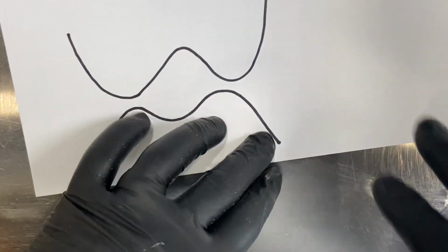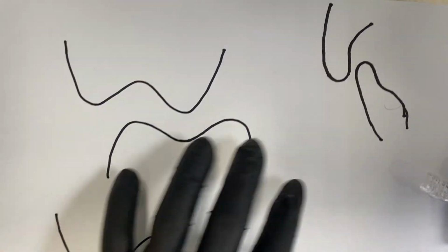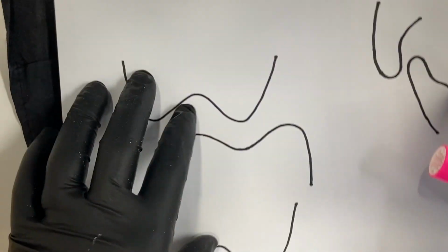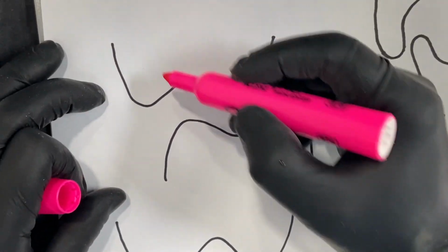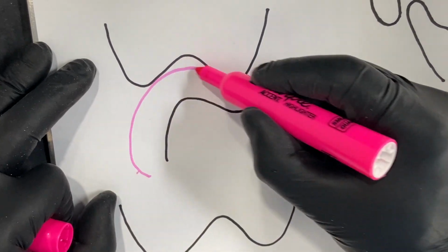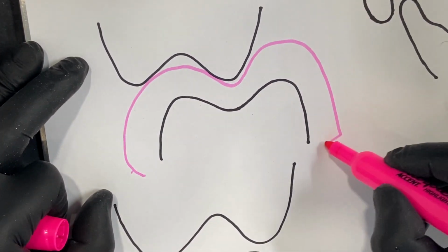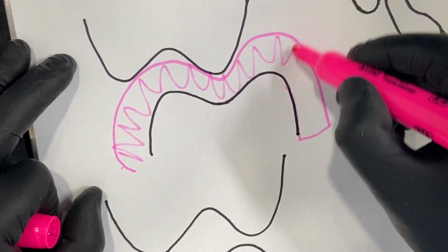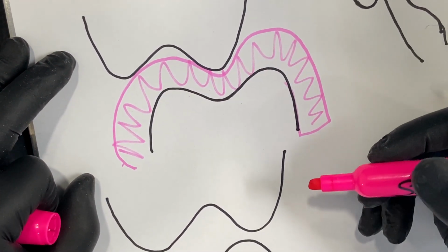Now, it's important that we understand these graphics that I'm going to show here, because this is what is happening most of the time. For instance, we have an upper model here, and this is a lower model. Technically, this is the space that we need over the lower model, and this minimal thickness needs to be 2 millimeters if you want to guarantee the strength that the manufacturer states, about 80 megapascals.